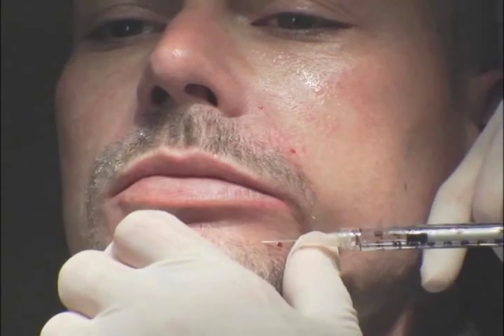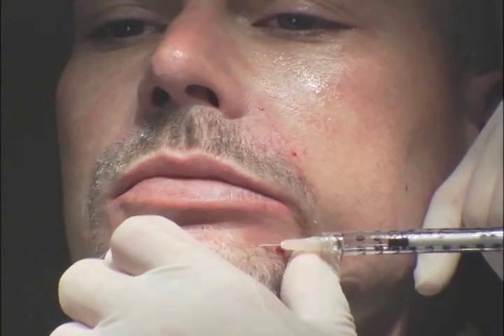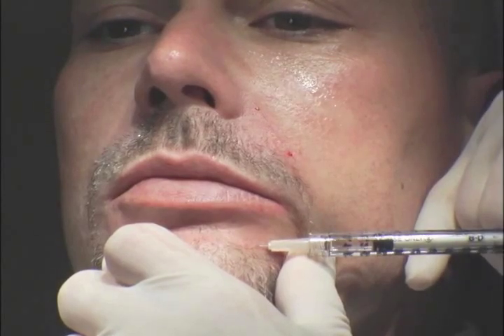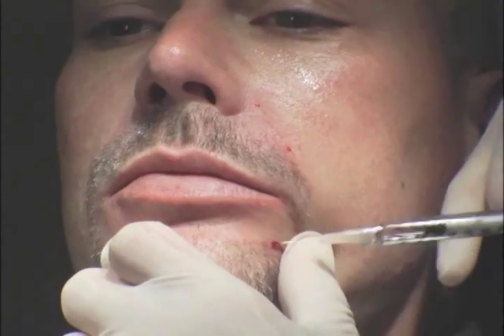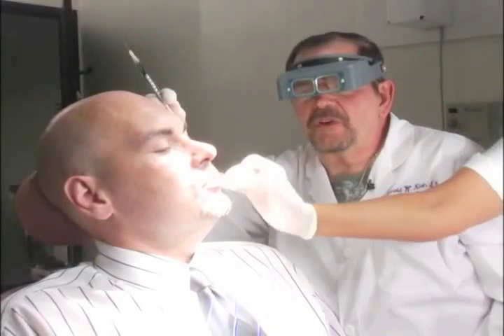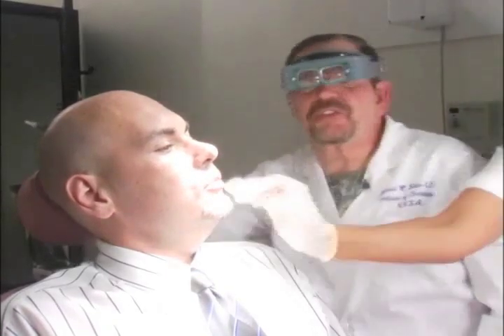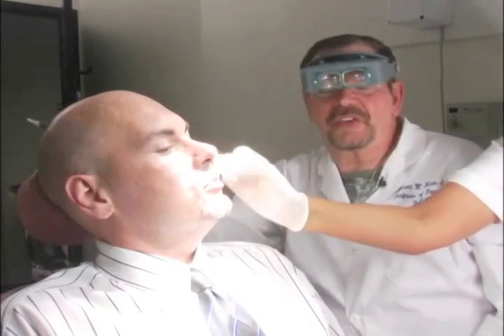Again, we're re-injecting the area, and we're again using serial puncture technique to watch material come up to the surface. Hold on. You want to wipe that off? So we have the corner of his mouth up. We see the dent of his lower third of his face is much better, and we see the end of his lips have been restored. Okay? You feel any bumps inside your mouth whatsoever? No. Okay. Let's go look at the other side now for a second, and we'll begin on that other side.